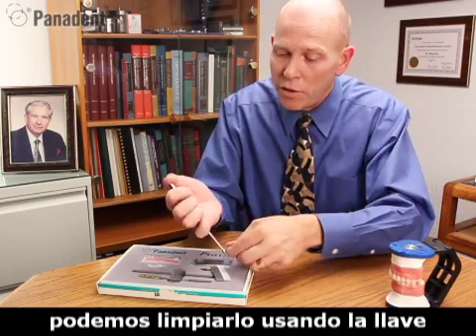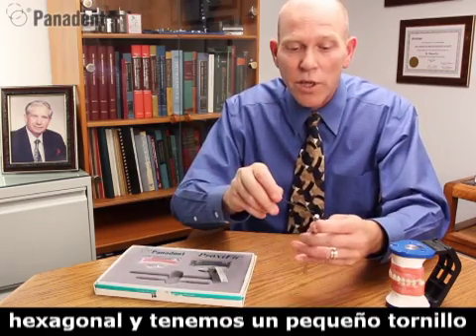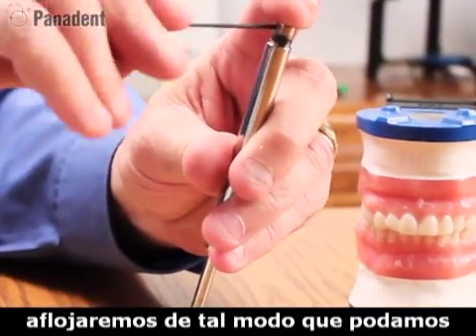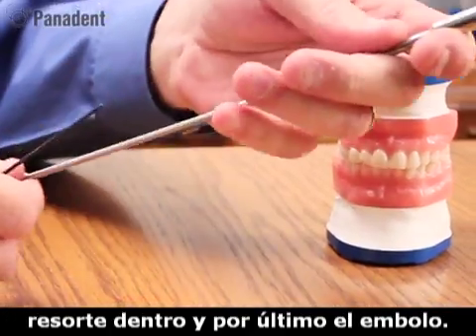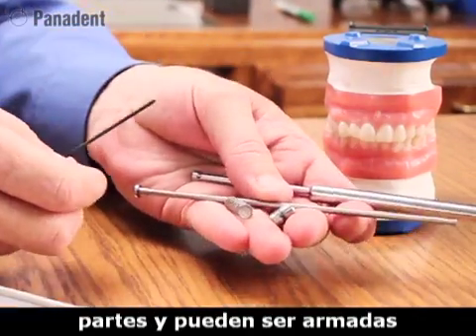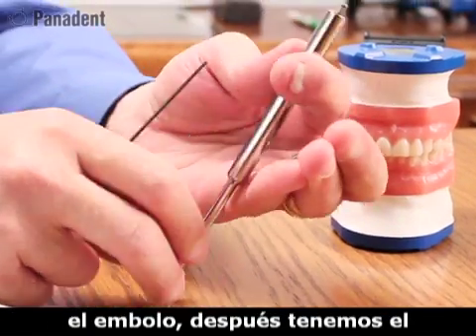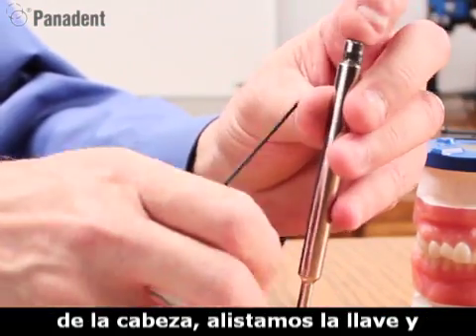It can also be cleaned by using the hex wrench here. We have a little set screw in the button, and we'll loosen that up so we can remove the button. Then we have the little spring inside, and then we have the plunger. So we basically have four parts, and they can be put back together in the same order by adding the plunger.